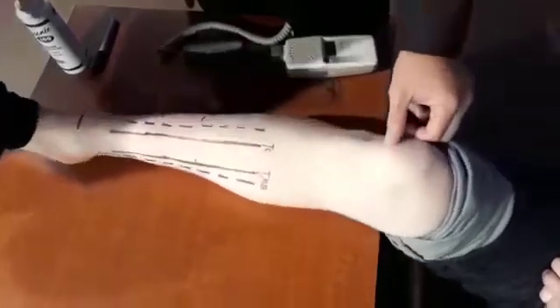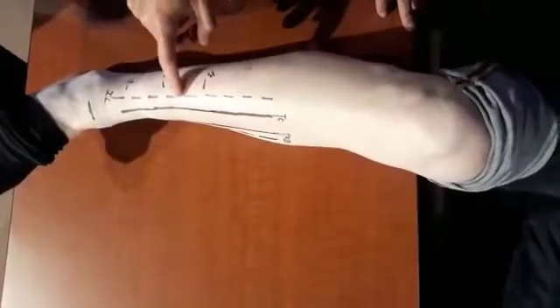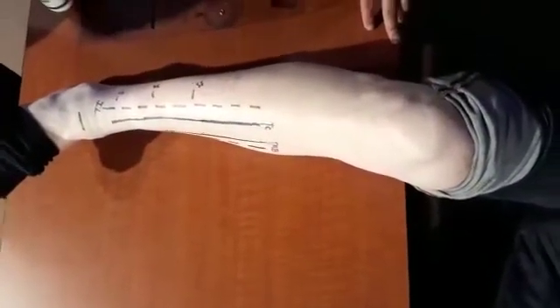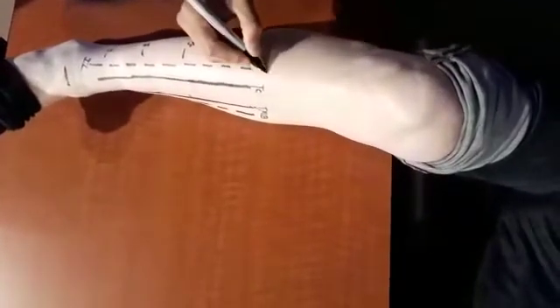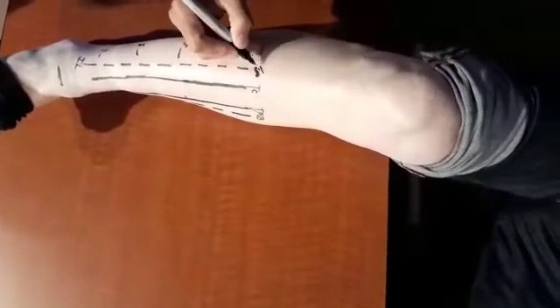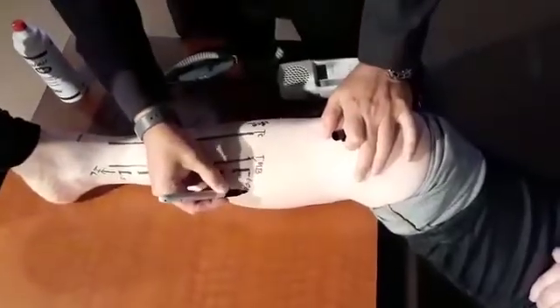If we go to the lateral side, we had the dotted line — it's 1.5 centimeters from the tibial crest. So I'm going to mark 1.5 so you guys can remember. And the dotted line on the medial side is one centimeter.